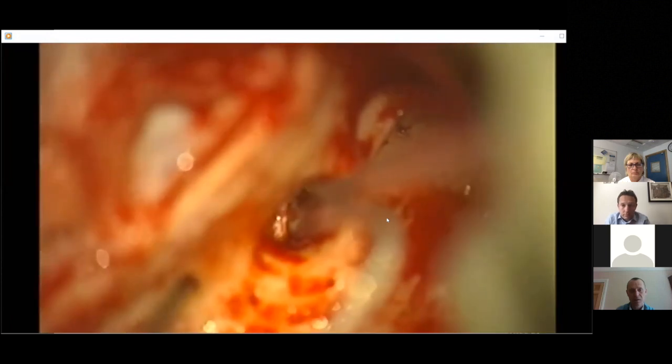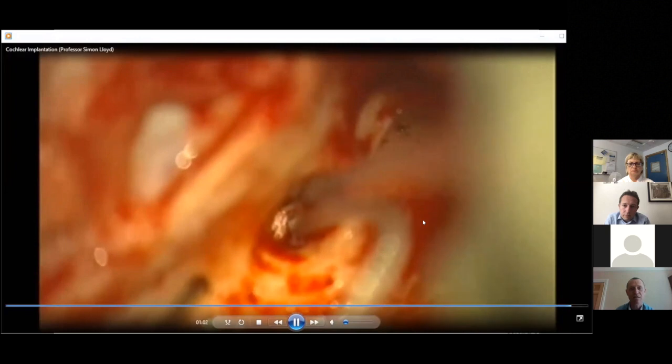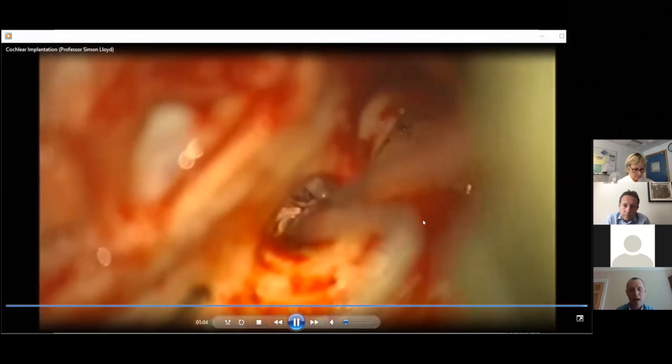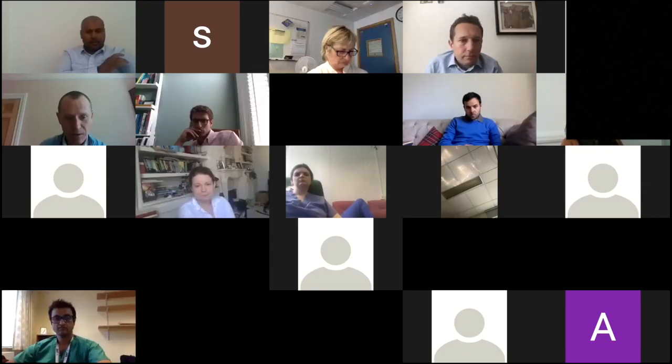And then once it's fully inserted, a little bit of muscle or fascia gets placed around it to seal the round window and try and stop any further perilymph leak. So I will now go back to the talk.